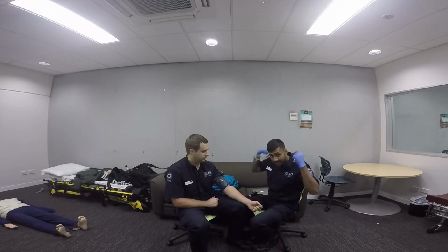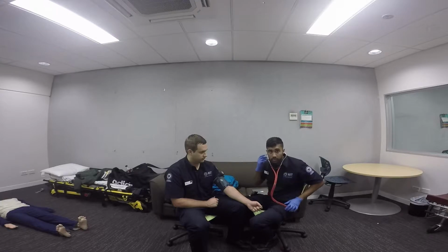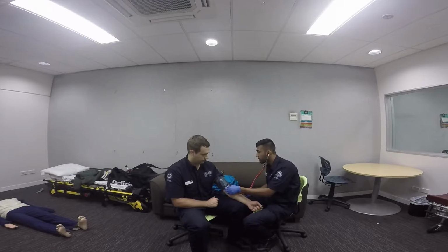Next thing I'm going to do is use the stethoscope and place it on the same area where I found Martin's brachial pulse, and that's what I'm going to use to assess his blood pressure. So I'm going to inflate the blood pressure cuff again, slowly releasing the stopper valve until I can start to hear the heart sounds. This will indicate our systolic pressure. And when I can no longer hear any more noises, this will indicate Martin's diastolic pressure.